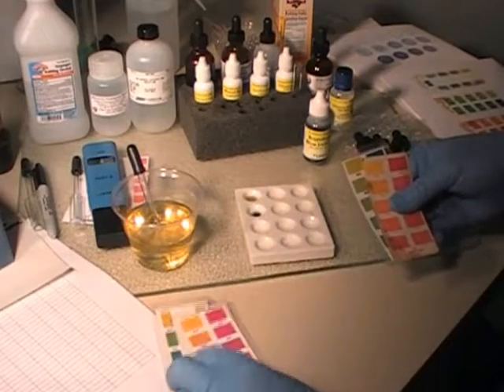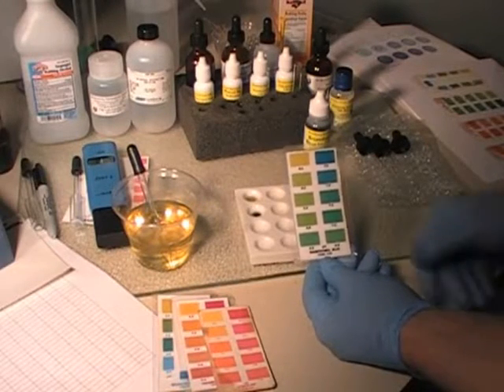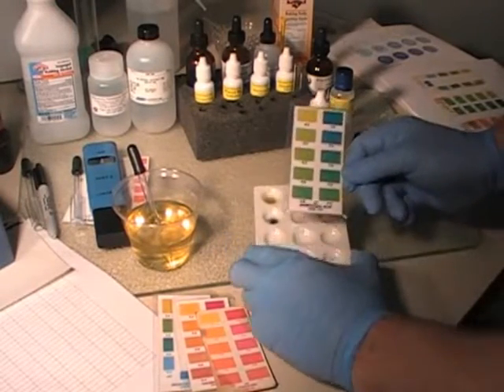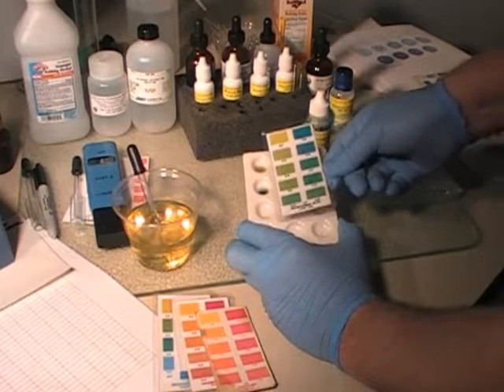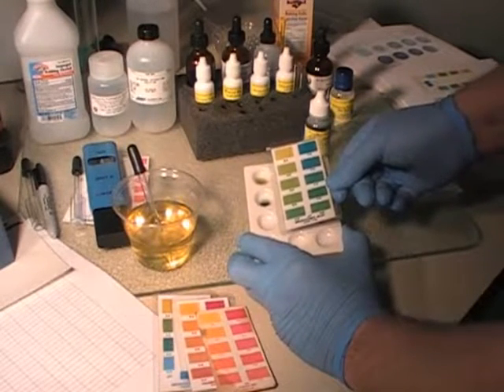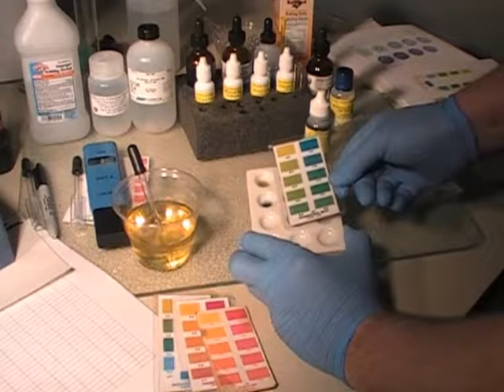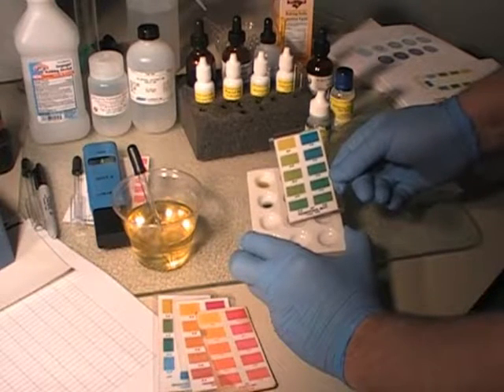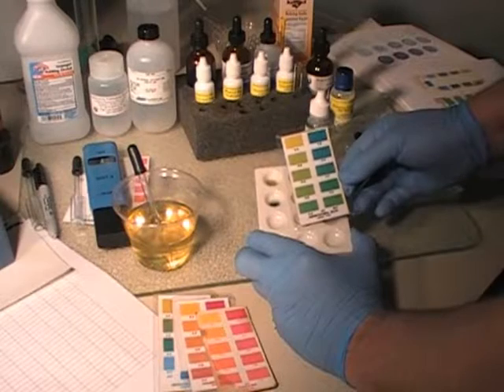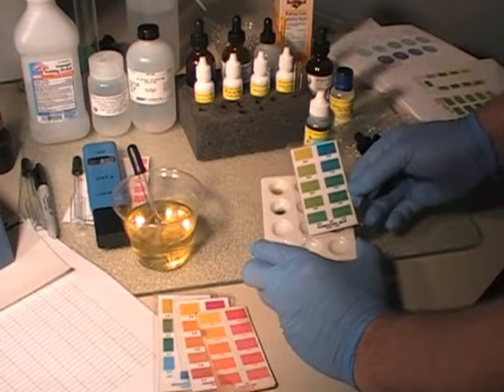Okay, what you want to do is use your bromthymol blue card, because that's the reagent we used. And we're going to first take a look and compare what we've gotten for readings here. So, for the camera's sake, I'm going to raise this up a little bit so you can see. And what you'll notice is that on that urine pH, and also I need to explain, it's very important to have good lighting here. If you can have natural light, sunlight, that's going to be your best lighting. The second best lighting that you can get are these natural lights called Vita lights, and I would highly recommend you get those. Fluorescents are going to be your third. And then after that are the regular light bulbs that we mostly use in our homes, and they are terrible. And you'll get off readings from them.